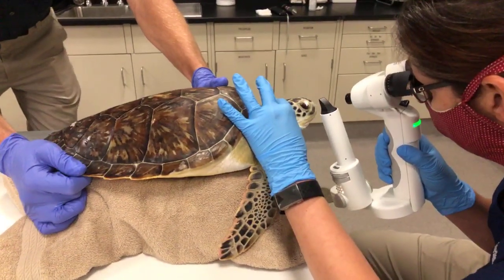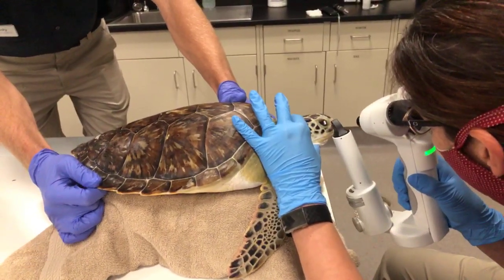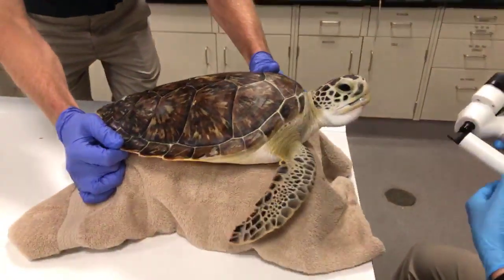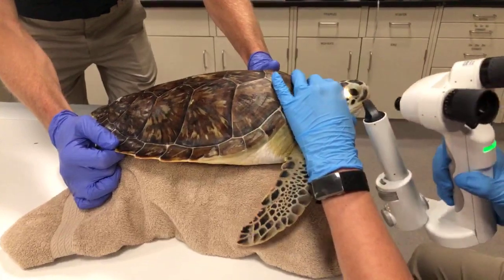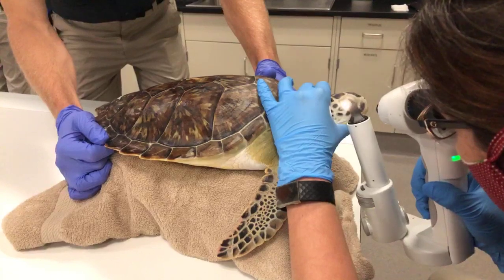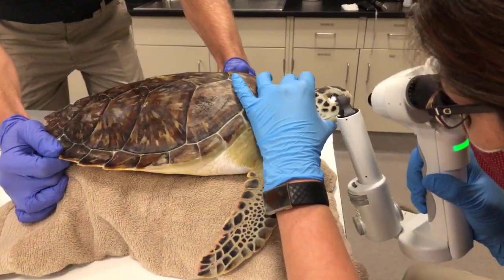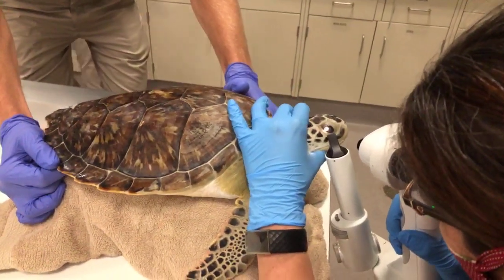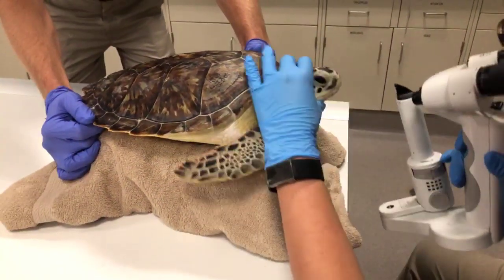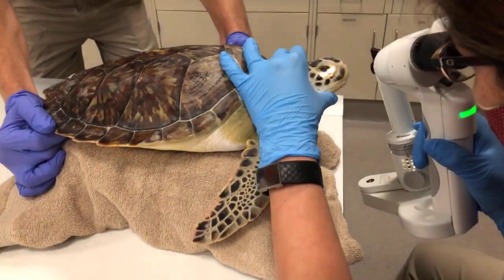Andy noticed and reported yesterday that this turtle has been squinting a lot and blinking excessively with both eyes, and that's not a normal finding. Most of the time our turtles don't seem to have irritated eyes. So we wanted to do a quick ophthalmic exam on it, and Dr. Merrow was using what we call a slit lamp, which is a really neat instrument that helps us see very clearly in the front part of the eye and the iris, and so you can see if there's infection or inflammation. You can see if there's a cataract or any trauma to the cornea.